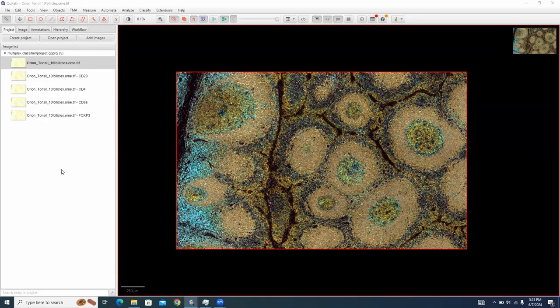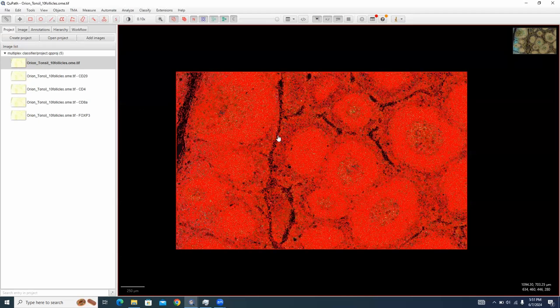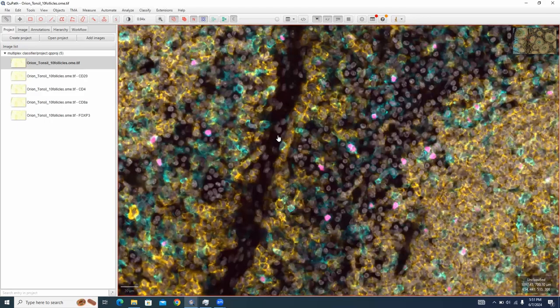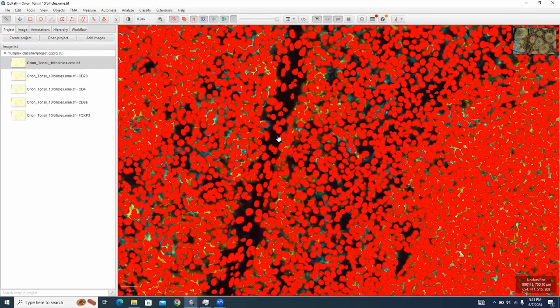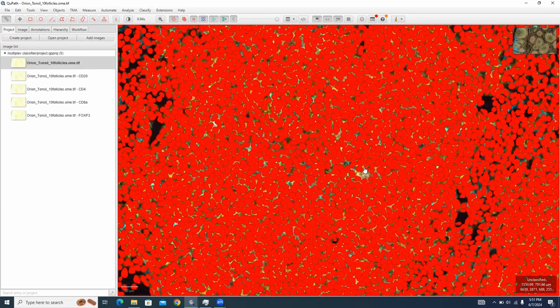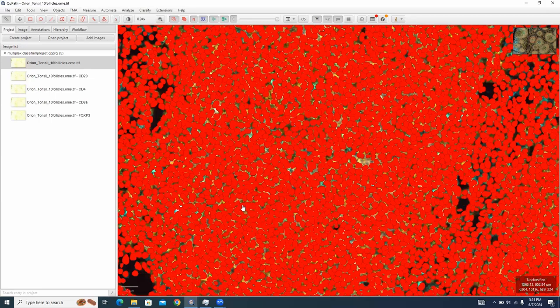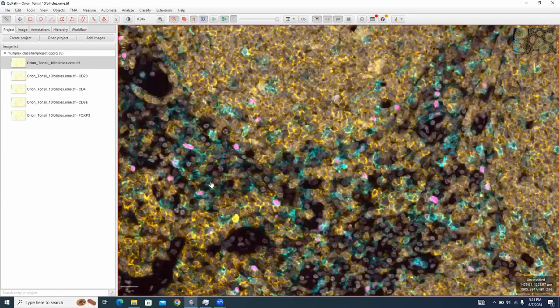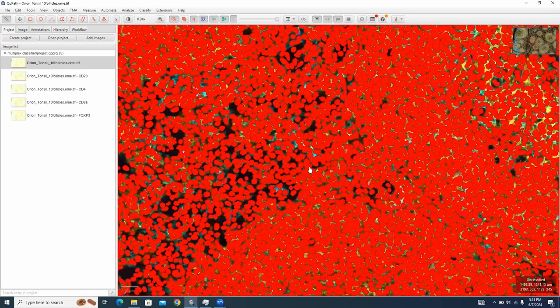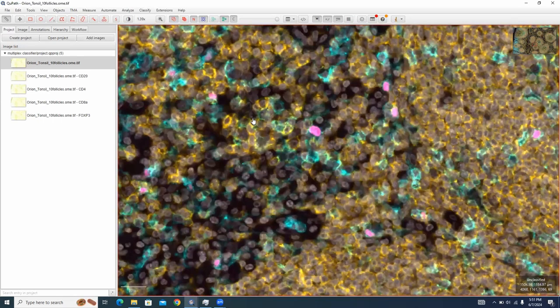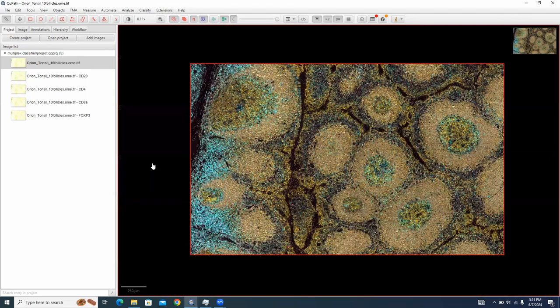Well, after the workshop, I spent just a little bit of time trying to optimize the analysis of this slide a little bit better than what I could do live on stage, and I just wanted to show you the results of that. First, I used StarDist to segment the cells, and as you can see here, the accuracy is actually pretty decent. It's not perfect, and if you go around, you can definitely find mistakes, like it lost the cell here, and there's something weird going on here, but overall, for as dense and as complex as this tissue is, StarDist does a remarkably good job. I also trained three classifiers, a CD20, CD4, and FOXP3, just like I did in the workshop. And in this case, I spent about 45 minutes trying to get them correct, which is of course more time than I could spend live.